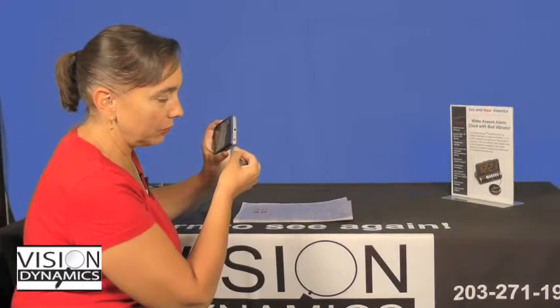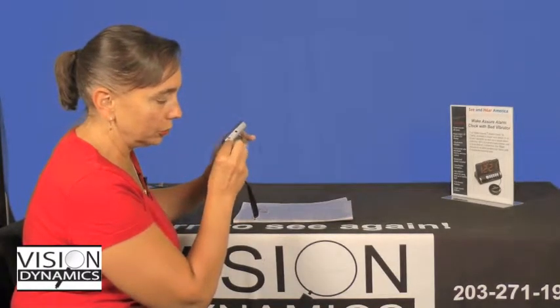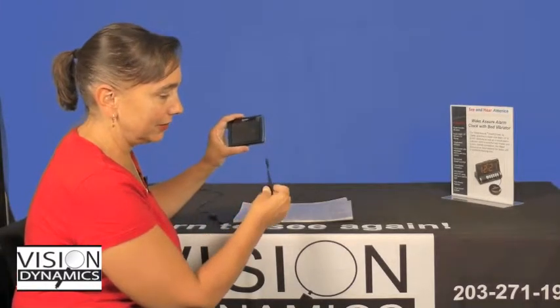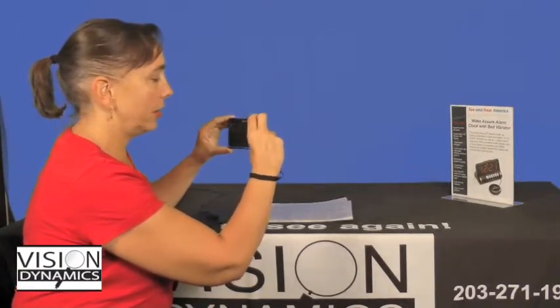If you're visually impaired, you may need a hand looping it through, and then you feed it through to create the knot. That sits there, and then it's great to have that wristlet around your wrist as you're using it, especially if you're in the grocery store. We'll talk about that in a bit.